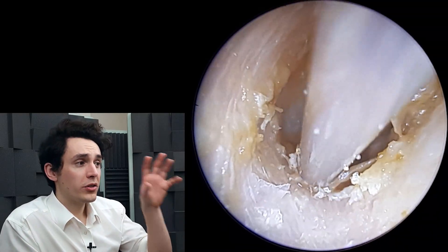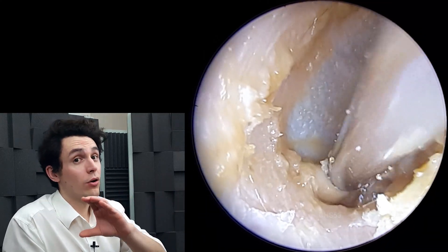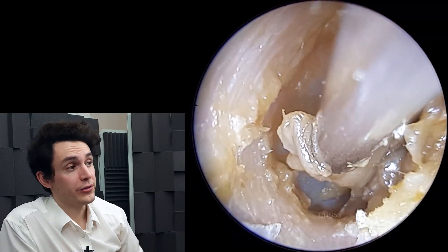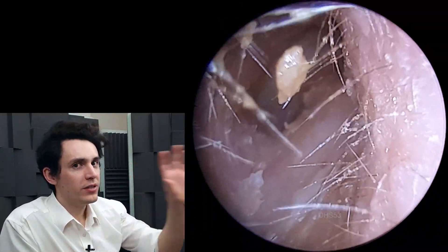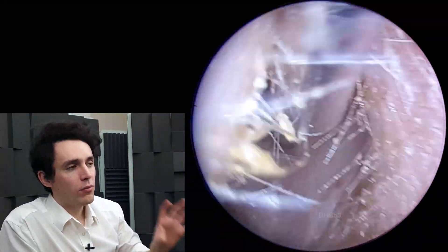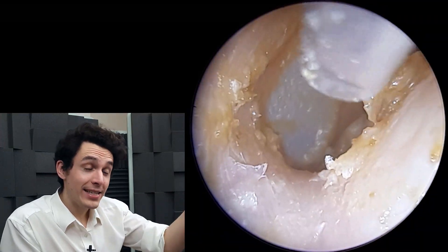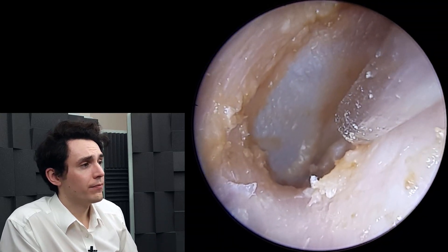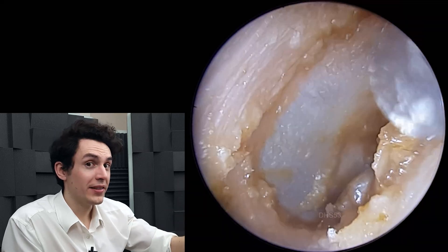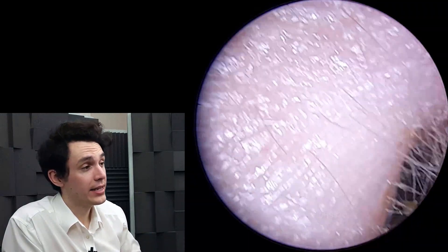From the start of the video, you could see that the ear canal wasn't actually completely blocked — there wasn't a wall of wax like you'll see in other videos, it was fairly clear, and the eardrum was visible in the background. But the problem was there was a lot of wax shoved up against the eardrum, pressing against it — which is kind of similar to if you want to hit a snare drum but someone's resting their hand on it; the snare drum isn't going to vibrate properly. And it's the same thing with the eardrum.